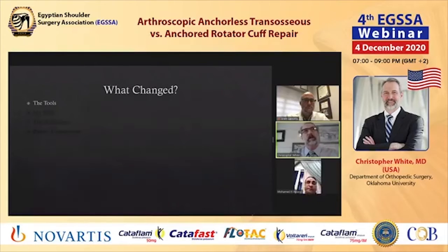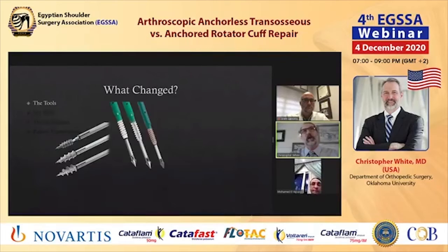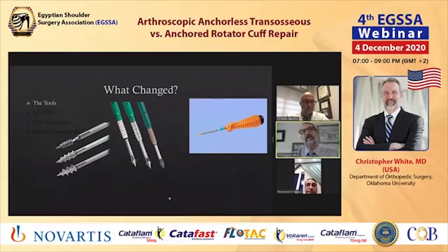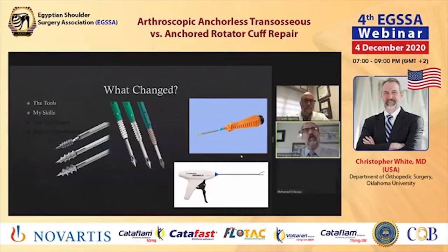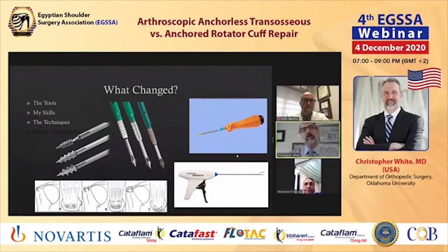But what's changed in my practice given that? Well, I think the tools have certainly improved from when I began my practice. We now have a whole host and multitude of different anchors that allow us knotless and knotted fixation constructs. We have easier ways of passing the suture through the tendon. Overall, we have more tools at our disposal to perform these rotator cuff repairs arthroscopically. Over the years, I'm sure my skills have improved to make this an easier technique. And frankly, I'm much more facile arthroscopically now, because I do those so much more frequently than an open repair. The techniques, I believe, have made me more comfortable. I think you can debate whether they've improved. I think they have, and I think the literature probably supports that.